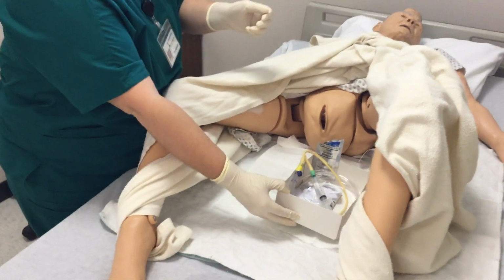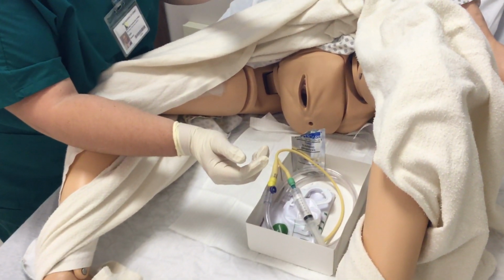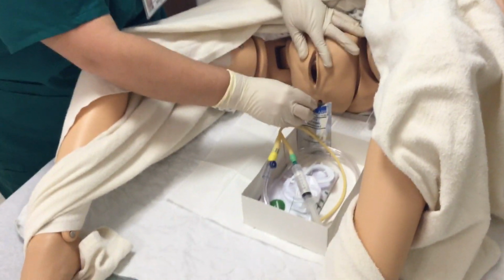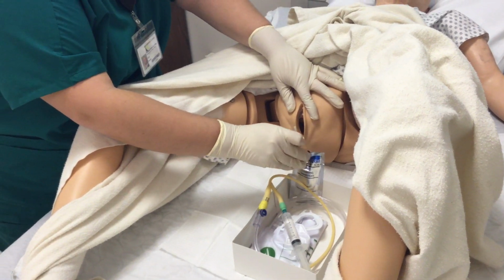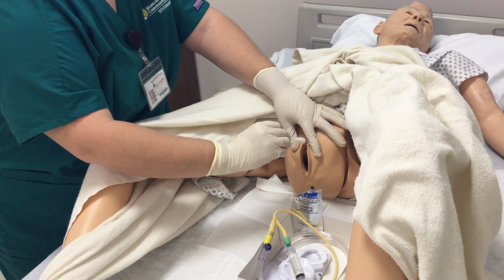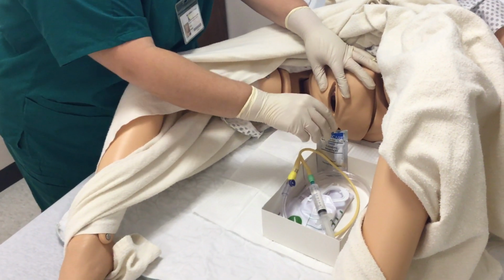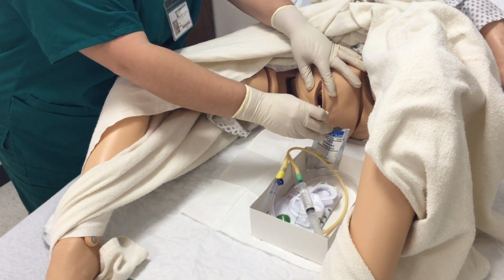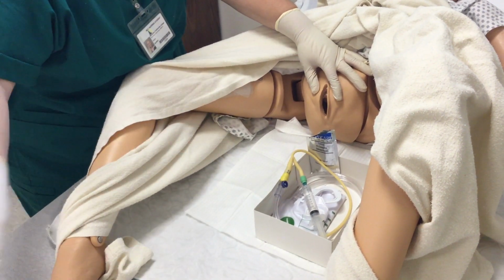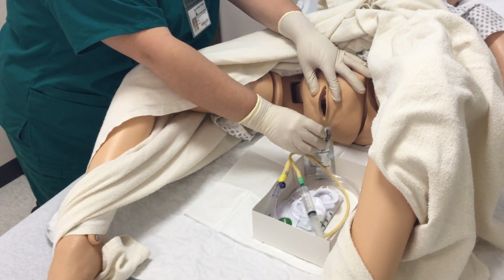So once that's good, this is my non-dominant hand now. I'm going to spread the labia, take that out. You don't need this either. I'm going to clean the labia farthest away from me first, and then the labia fold closest to me, and then right down the center.